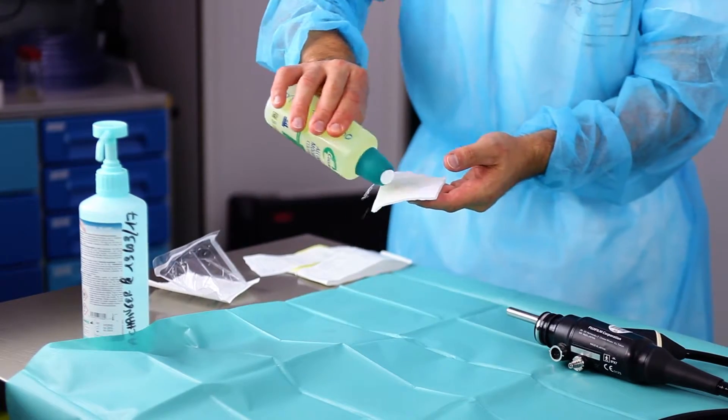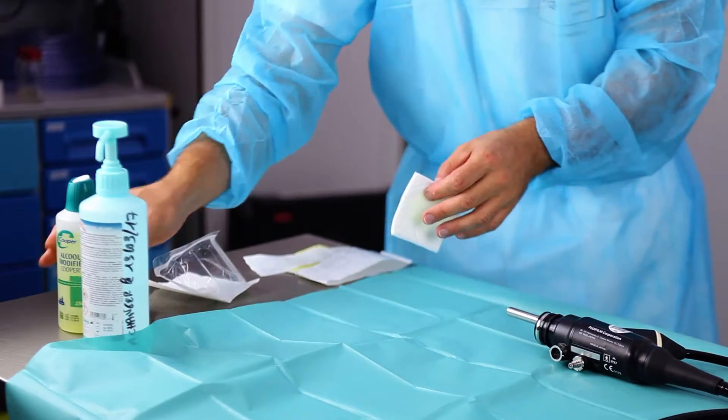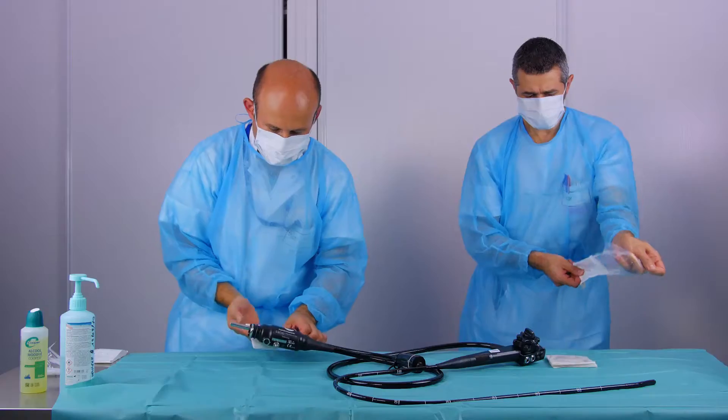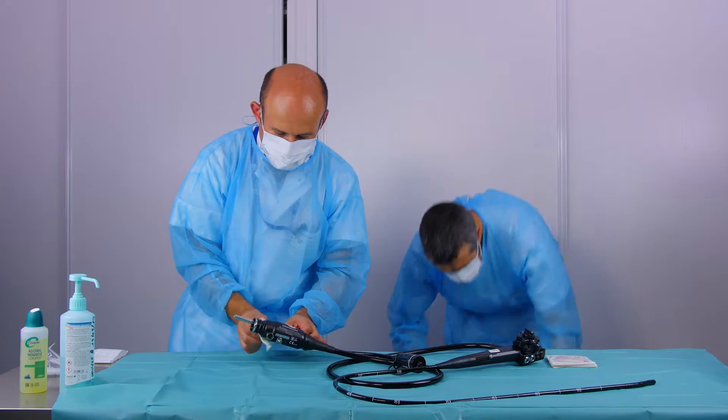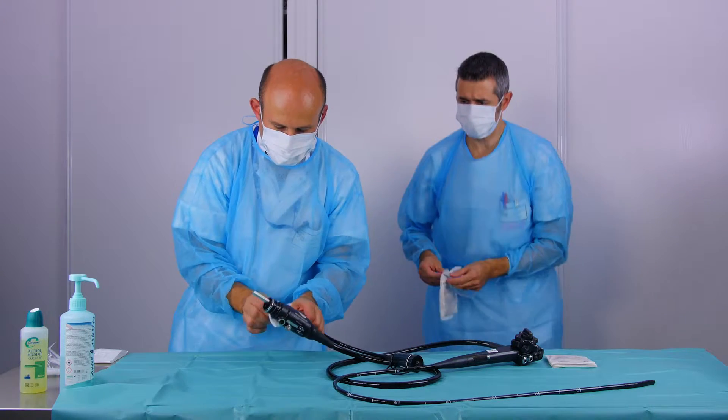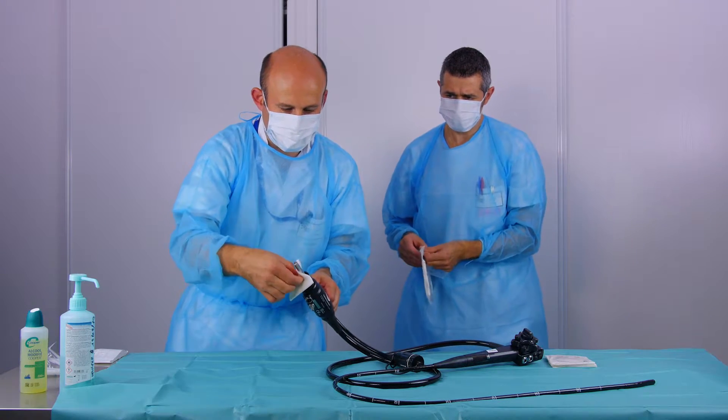Disinfect the injection ends — proximal and distal — using a sterile compress with surgical spirit.